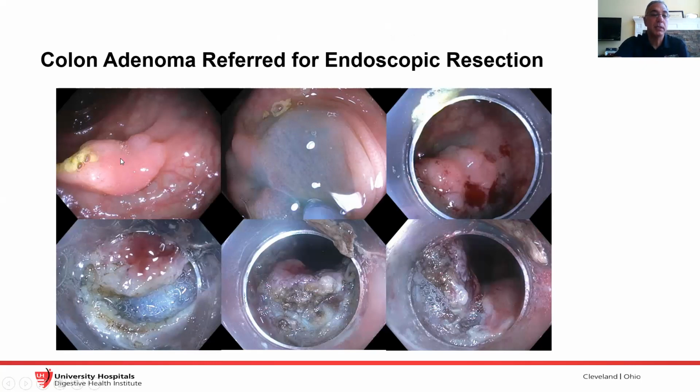stubborn polyp. This is a transverse colon polyp. You can see here we have some convergence of folds. This is a depressed area here. I thought I saw some granular features here, but in retrospect, probably not. This is a submucosal injection to assess the lift.